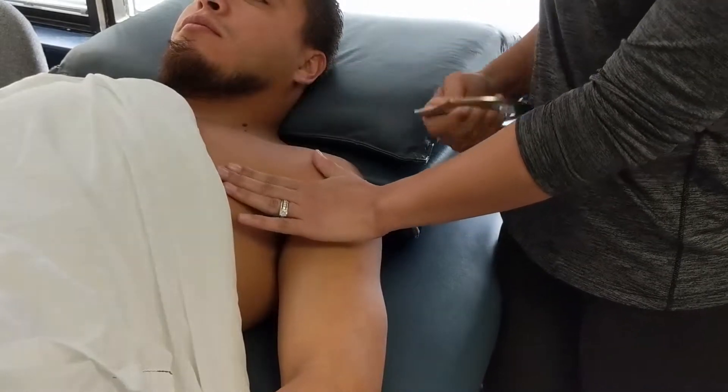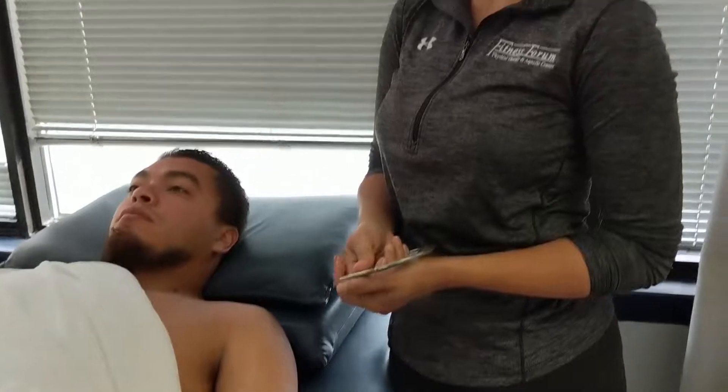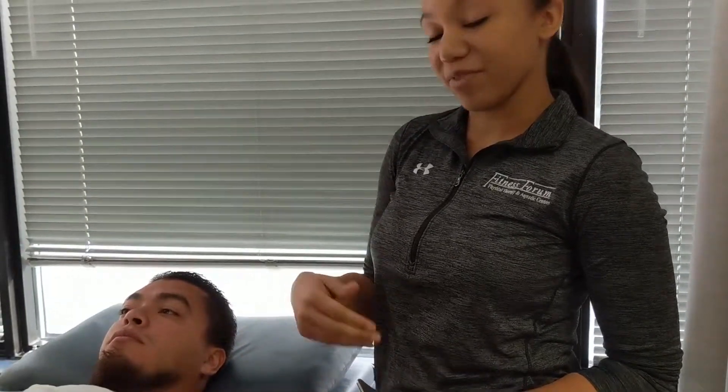Typically you do this for about two to five minutes — you'll notice the skin kind of pinkening up. Afterwards, you're always checking in with your patients, making sure they're okay and not having any adverse reactions. Then you have the patient sit and retest their mobility and assess their strength. After that you might do some isometrics — go back to your PNF techniques, your contract-relax. Make sure you're setting up a proper home program so they can maintain that new range of mobility you've just provided with your instrument-assisted soft tissue mobilization.